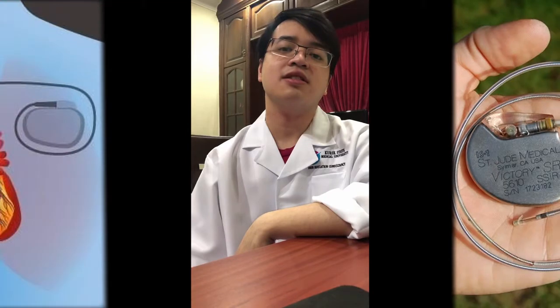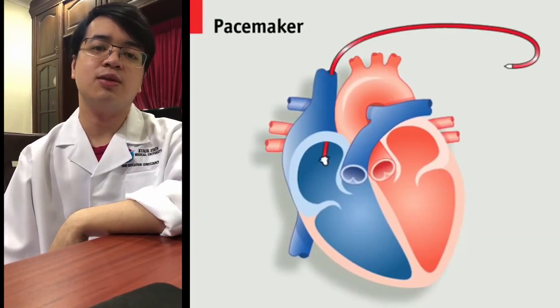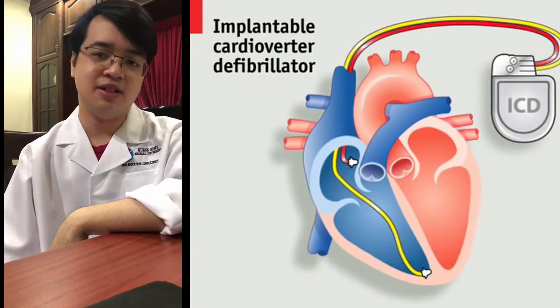I'm from group 26, and today I'm going to explain what to do when observing a patient with a pacemaker implant. But first of all, what is a pacemaker? A pacemaker is an electronic device implanted under the chest of the patient and sends electrical current to the heart muscle. The electrical current will help the heart muscle to contract better.